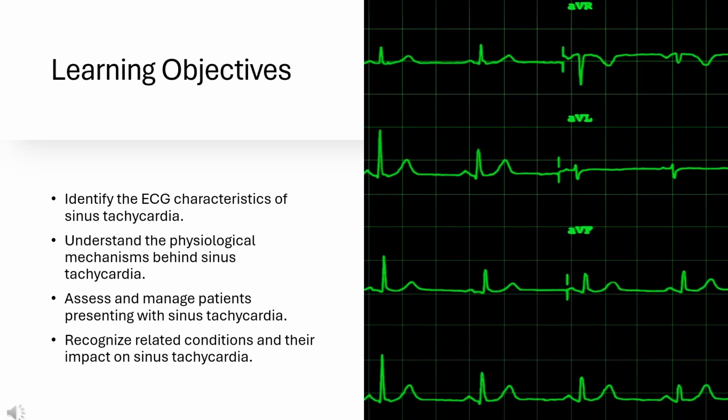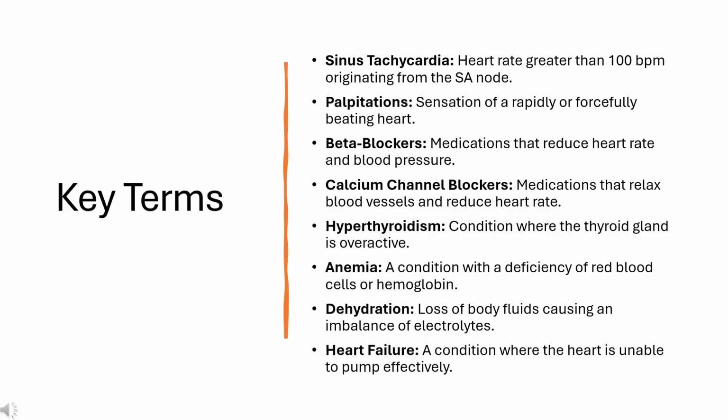Let's look at the learning objectives for this presentation. By the end of this presentation, you'll be able to identify the ECG characteristics of sinus tachycardia, understand the physiological mechanisms behind sinus tachycardia, assess and manage patients presenting with sinus tachycardia, and recognize related conditions and their impact on sinus tachycardia. These are the key terms for this presentation.